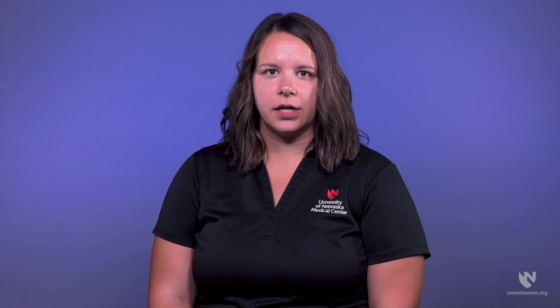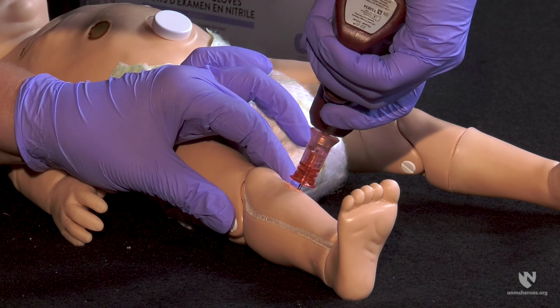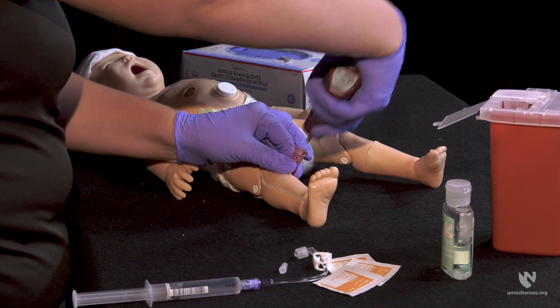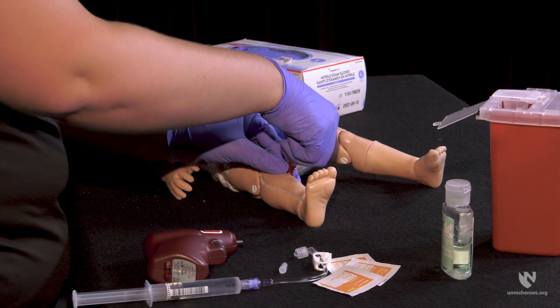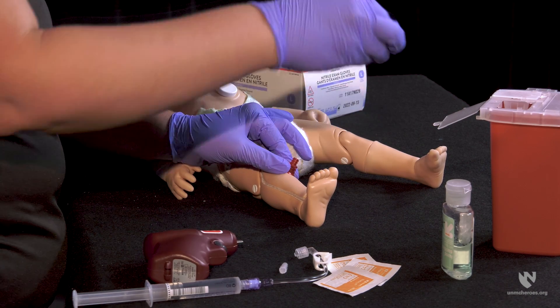Next, squeeze the trigger and apply gentle pressure, allowing the drill to do most of the work. Once you no longer feel resistance, stop the insertion and remove the drill from the needle set. Then remove the inner needle and dispose of it in the sharps container. The IO site should feel firm and seated into the bone.